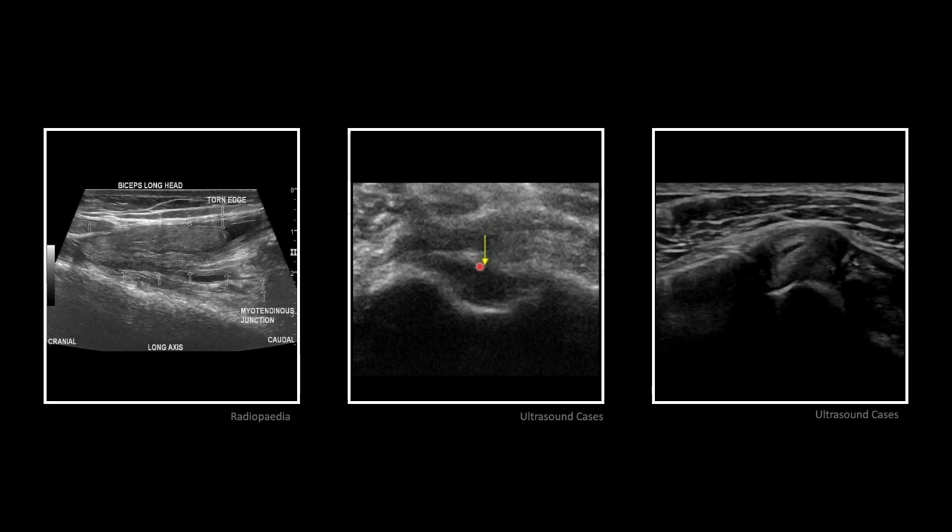of a tendon. And then lastly, the image on the right shows another short axis view of the biceps tendon, this time with an intratendinous tear. So here we see the tendon and it's sort of split with this hypoechoic structure kind of in the middle, as if we were staring down the barrel of the tendon. All of these are different examples of tears and ruptures that you may encounter, but even though all of these are similar processes, the way that they presented on ultrasound were pretty different. And so you need to be familiar with what normal looks like, and if anything varies from normal, you should be suspicious for a pathology.